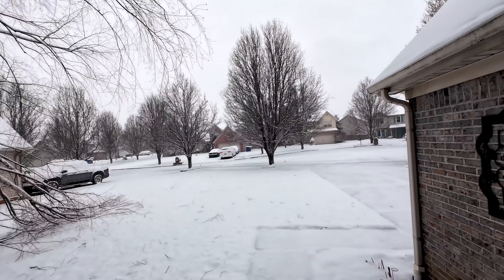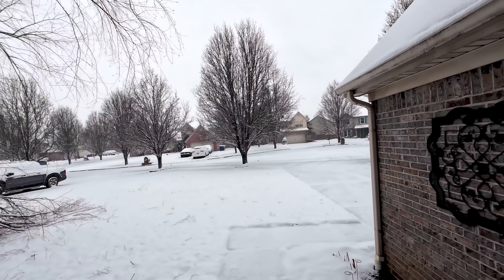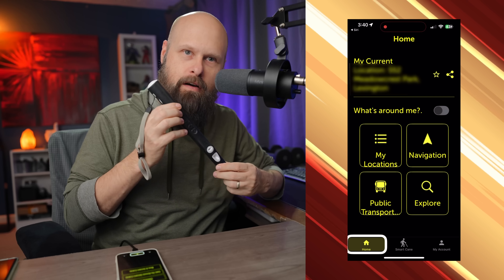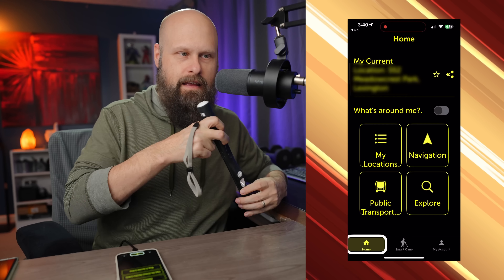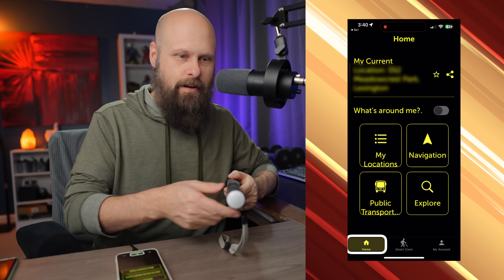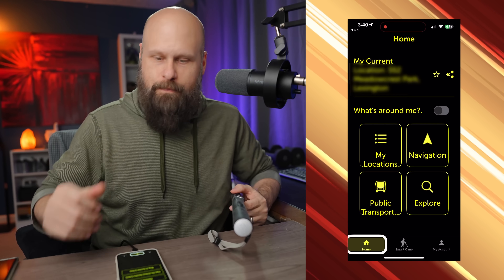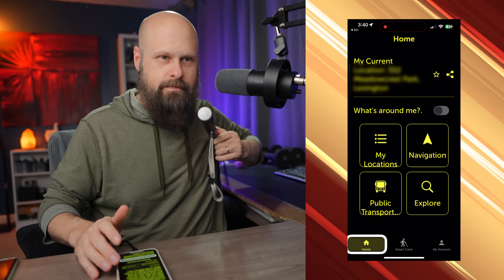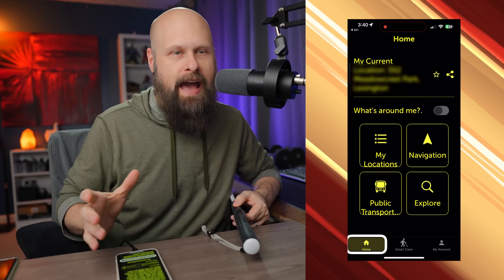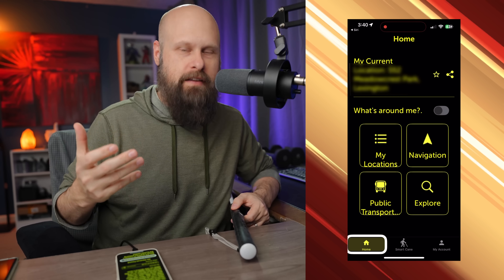It looks like we got yet another snowstorm last night, so let's jump back into the studio and talk about using the WeWalk app with the new WeWalk Smart Cane Version 2. With the app running on the phone, we turn on the Smart Cane by long pressing the power button and hear it boot up. After a couple of seconds, the cane automatically connects to the phone and everybody's working well together.